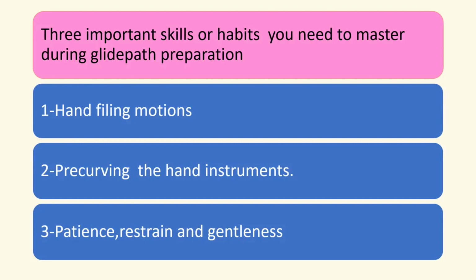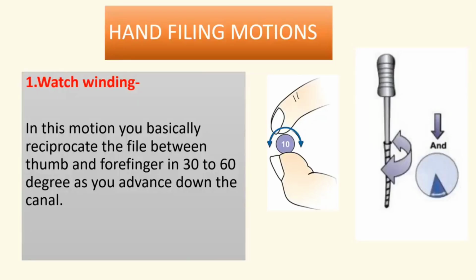Secrets of successful glide path preparation. According to my opinion, these are three important skills or habits you need to master during the glide path preparation. First is the hand filing motion, second is pre-curving the hand instruments, and third is patience, restraint, and gentleness.